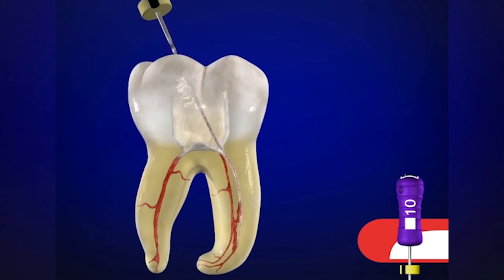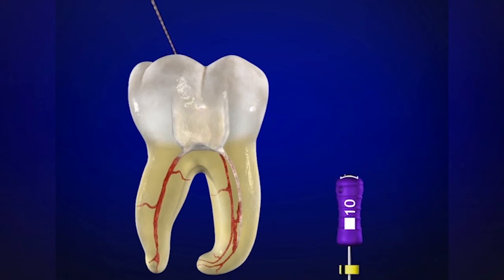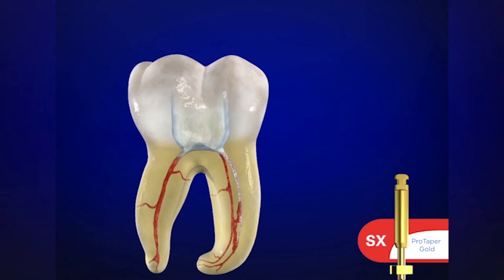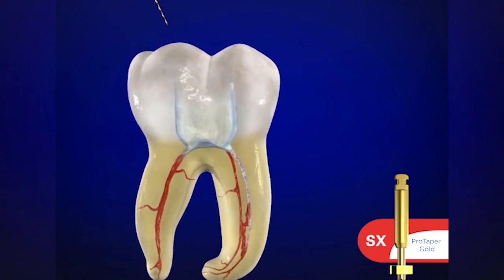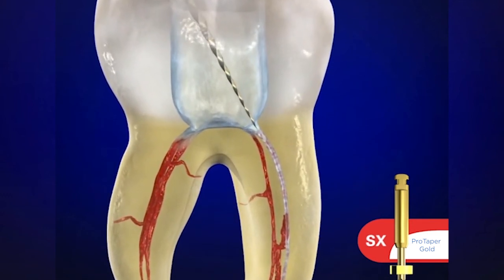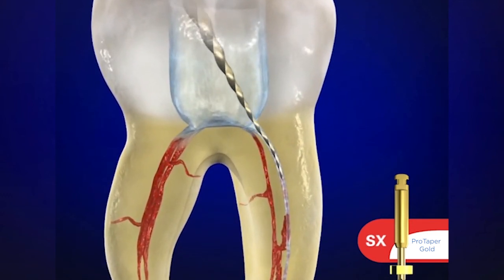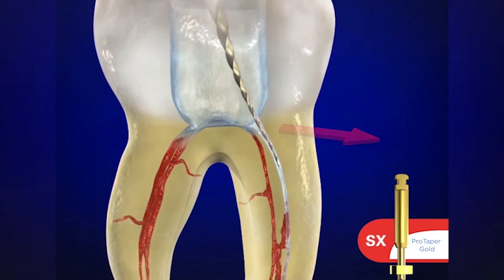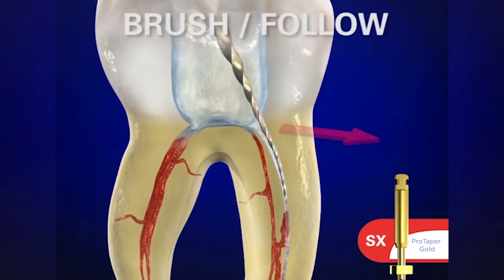Now this instrument can be removed, and we can place the working length on this file and transfer it onto ShaperX. Remember to irrigate and flush out all the viscous chelator. ShaperX is not to cut towards its working end — we want the workload to be pushed up to the bigger, stronger, and more efficient blades.